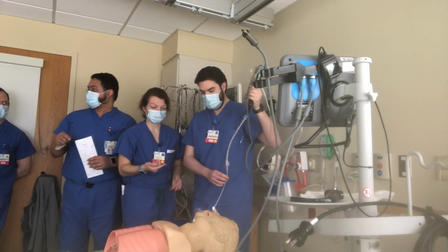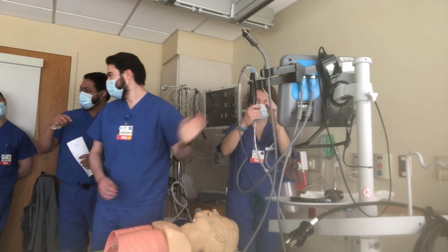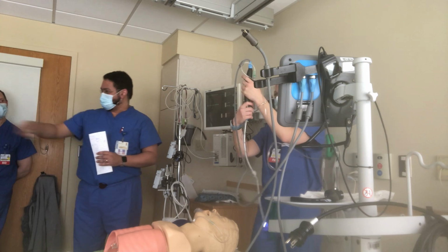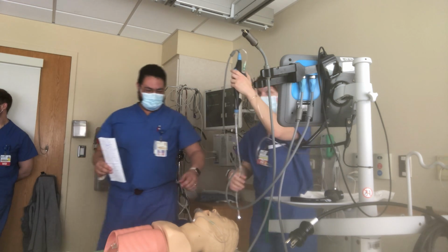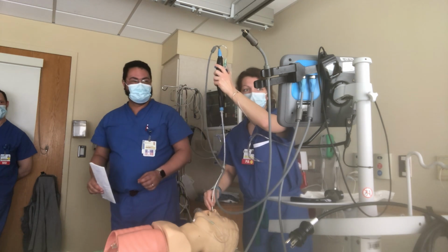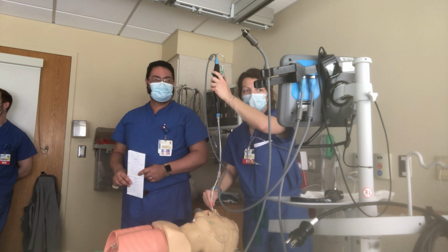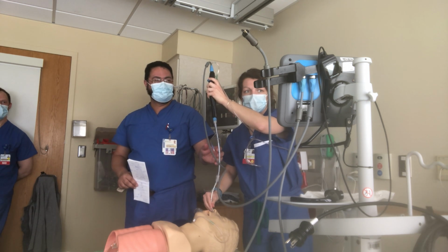Nancy, I'm gonna have you intubate. This is gonna be the first physical therapist that intubates. Come on. Probably about 30 years ago, we had a patient with a C2 fracture down in the rehab gym, and she coded on us, and somebody handed me an airway, and I'm like, yeah, no. Thank you. Perfect.